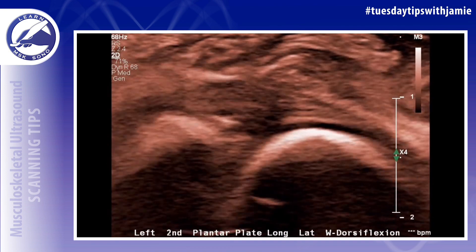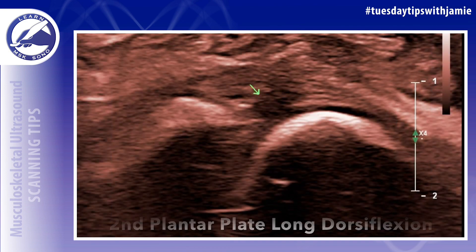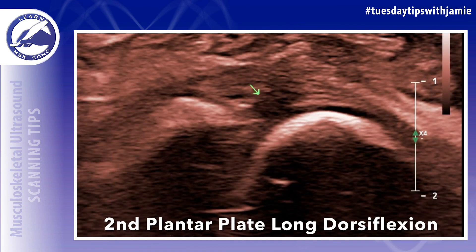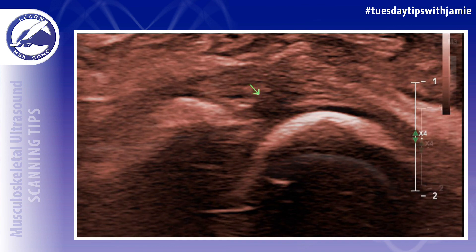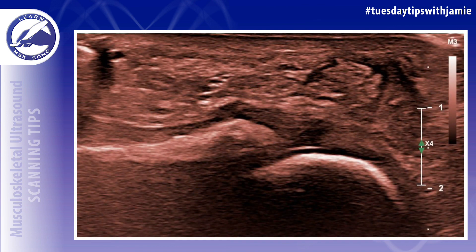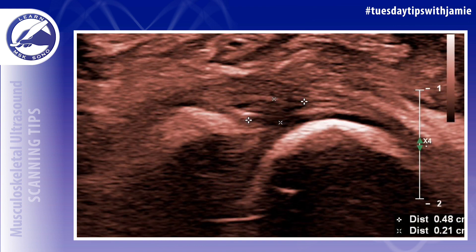Plantar plate tears can be partial or full thickness and appear as a focal hypoechoic defect in the normally echogenic substance of the plantar plate. Plantar plate tears most commonly occur at the lateral insertion of the second plantar plate at the level of the MTP joint.